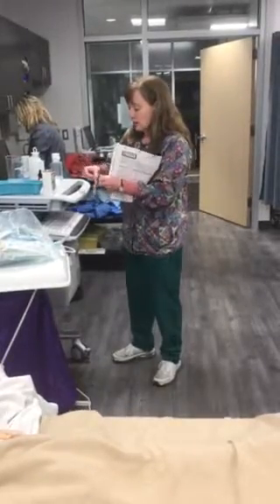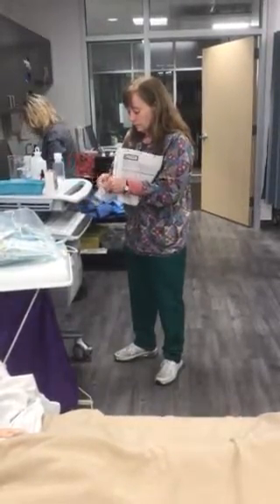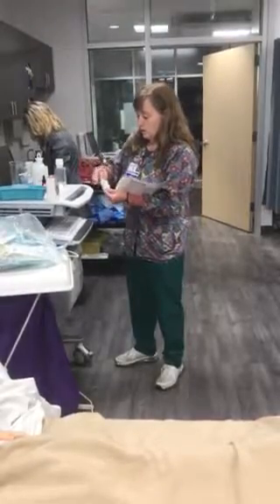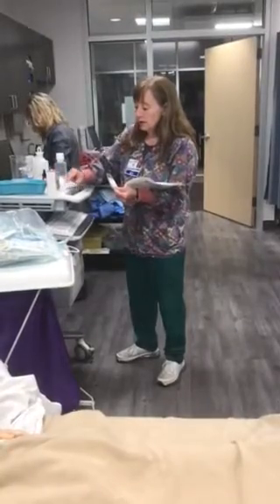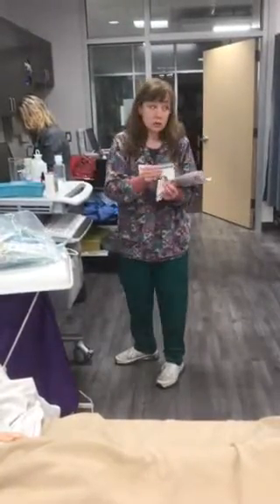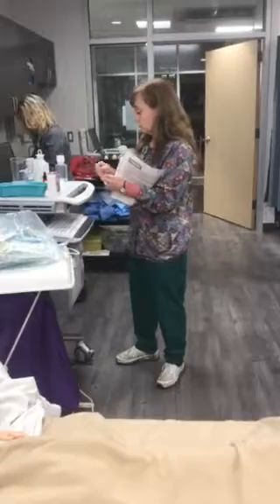So we could take one of these out and put it in one of our containers. We can go ahead and get our label, put it on there, and make sure, so that way when we do our second med check, we'll have everything labeled.